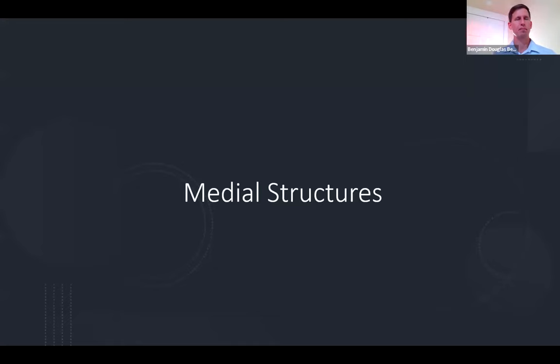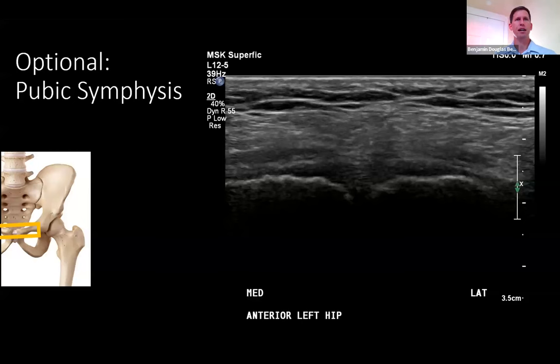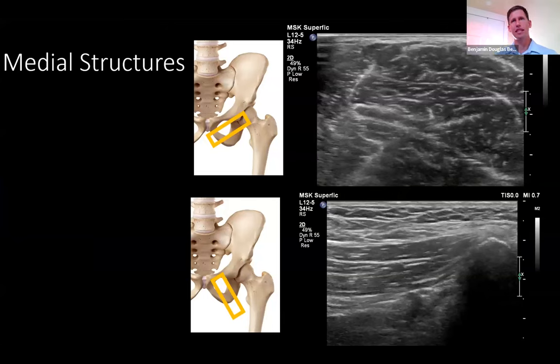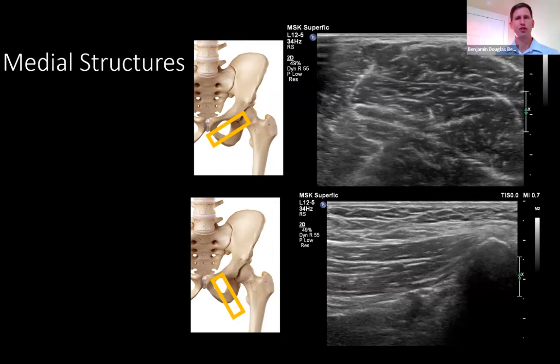I don't always evaluate every medial structure, but for completeness, the pubic symphysis is midline just over the genitalia — look for signs of effusion, hyperemia, or cortical irregularities that might represent osteoarthritis. You can also evaluate the adductor longus, adductor brevis, and adductor magnus in both short and long axis.